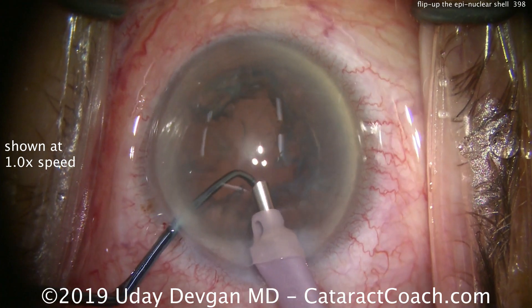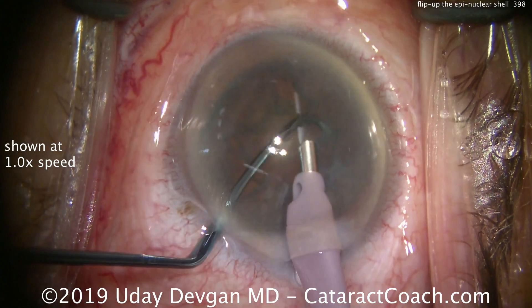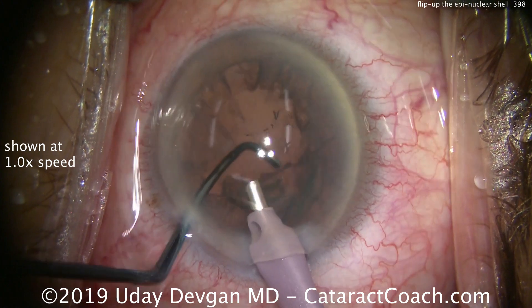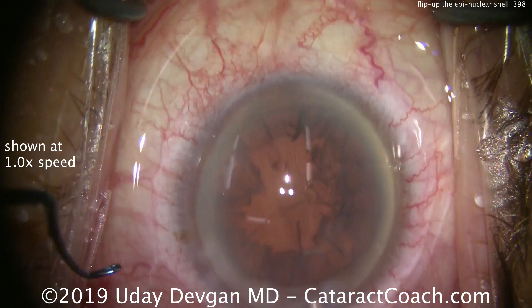We use low vacuum to grab the epinucleus shell with the phaco probe — just vacuum, no energy. Once we get a hold of it, we use the chopper in the second hand to flip it up, and then we can aspirate the whole thing away from the capsular bag. Let me show you in slow motion.